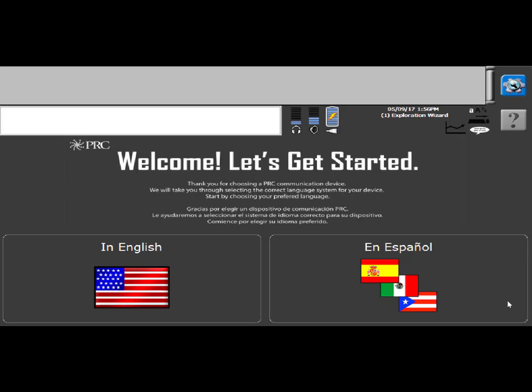Okay, so when a UNIDAD configured accent is ordered, when you turn on the device you will be taken directly to the exploration wizard. And here you can either get an overview of the product in Spanish or in English. Today I'm going to do the overview in English, so I'm going to select that.